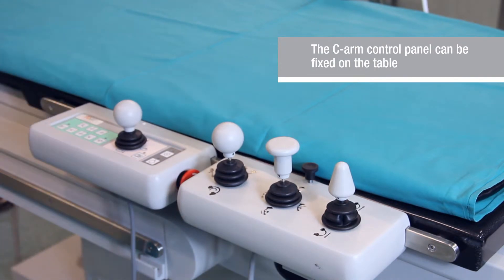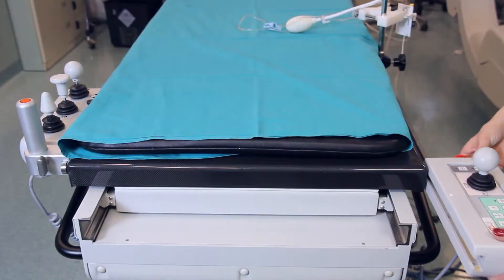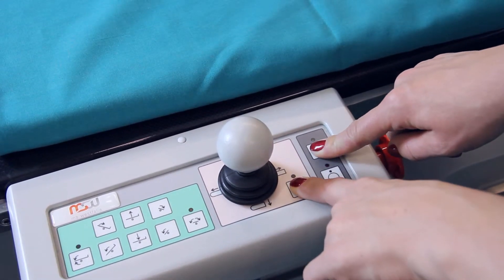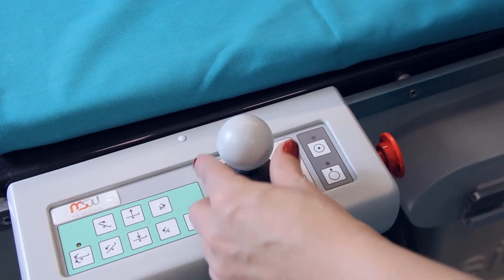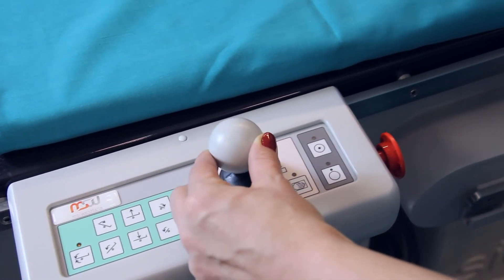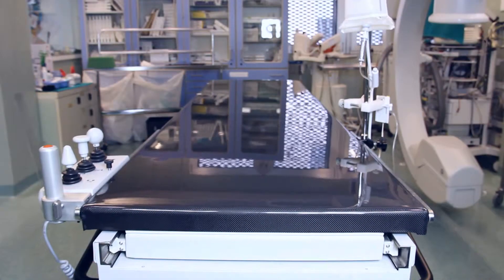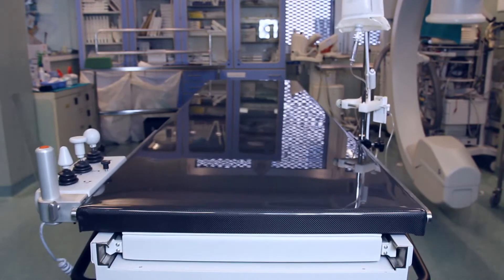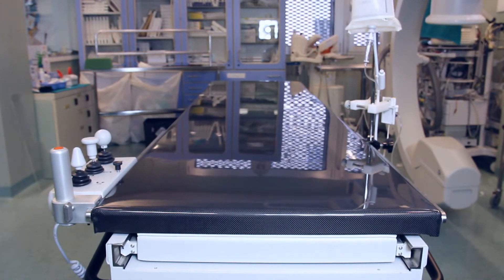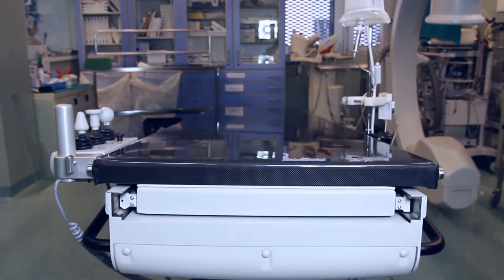All removable control panels of the C-arm and the table can be attached in any order using special rails. If the joysticks are attached to the opposite side of the table, they may easily be reprogrammed. The table top is made of durable and light carbon fiber reinforced plastic, moves in any direction, and the table is equipped with a complete set of additional accessories.